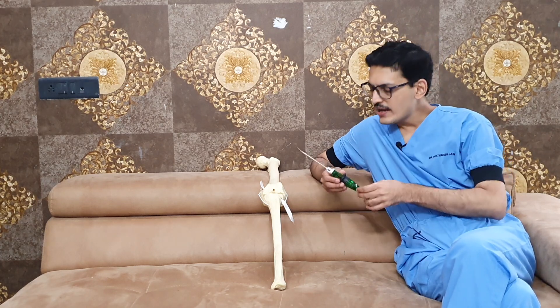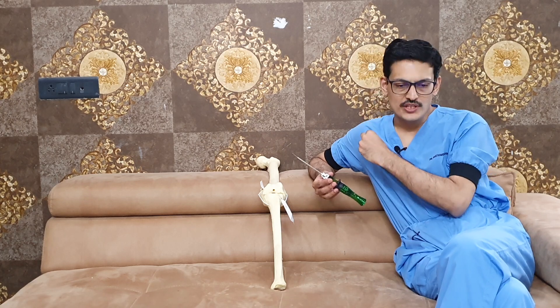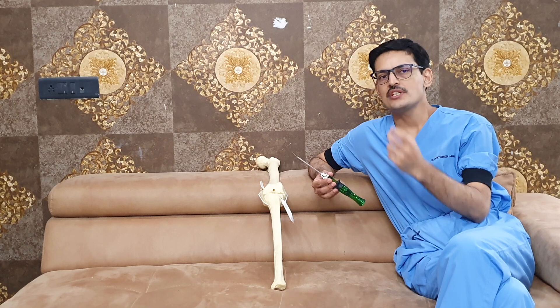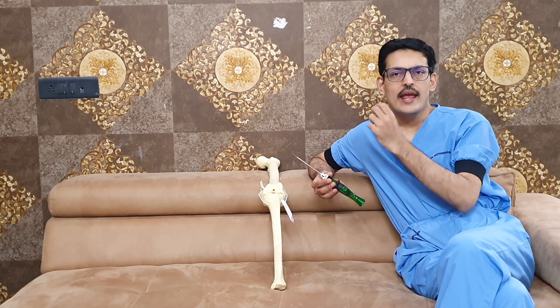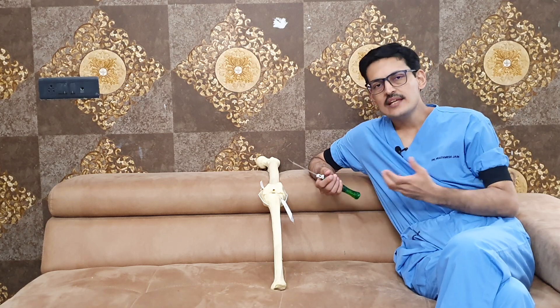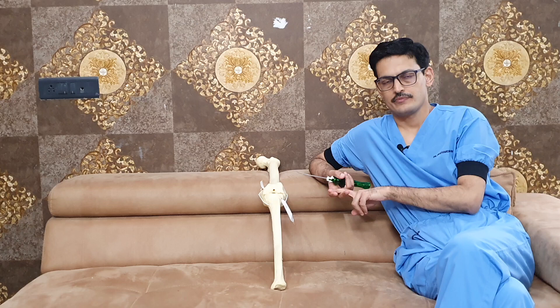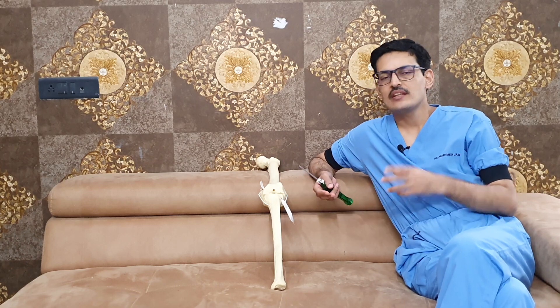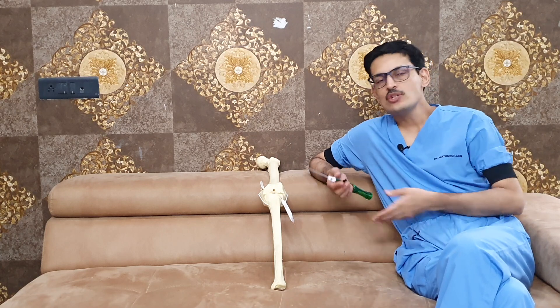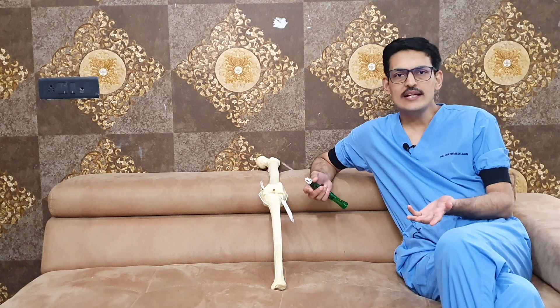The advantage of this technology is that it is based on two technologies. First, the implant uses the Juggernaut technology — that is the all-suture implant. Second, the locking is based on the zip-loop technology, which is a very good locking mechanism between the two loops. There is a blue loop and a white loop, and the advantage of this system is that both loops can be independently tensioned.